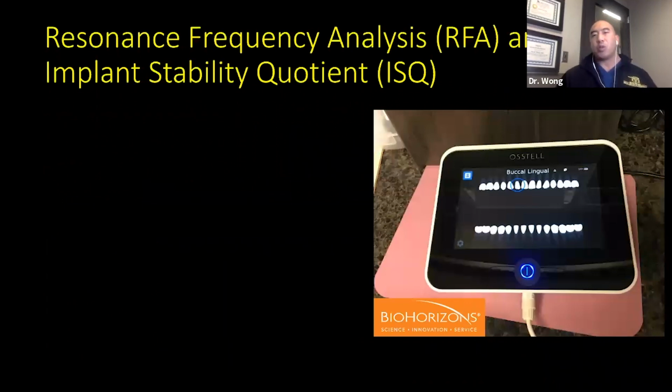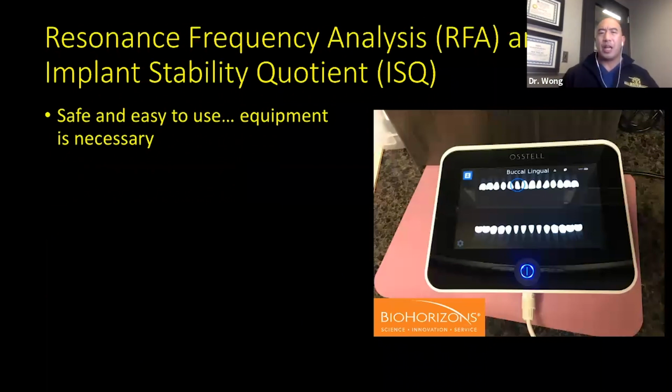The resonance frequency analysis, or the implant stability quotient, the ISQ. So what is that? You may have seen this machine. I happen to use the Osstell. I get it through BioHorizons. You can buy it directly through Osstell as well. It is also safe and easy to use. It does not harm the implant, unlike the reverse torque test, where if you torque it out, you torque it out. This is nice, safe, and easy to use, but you do have to buy the machine, right?